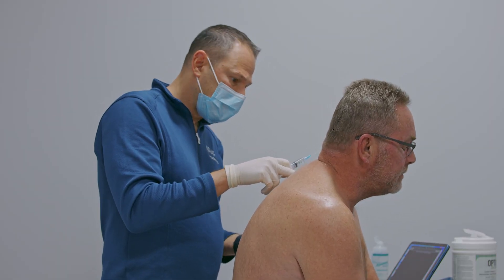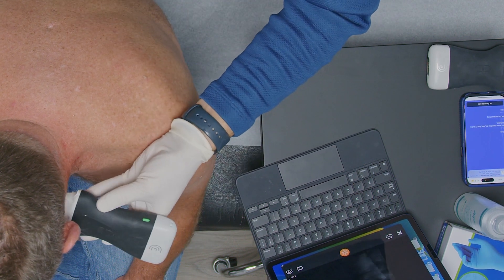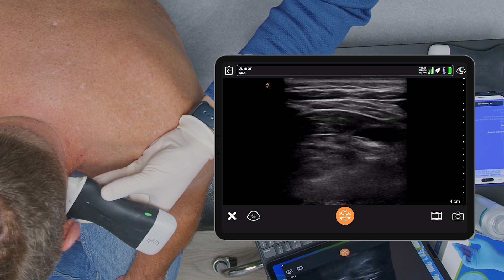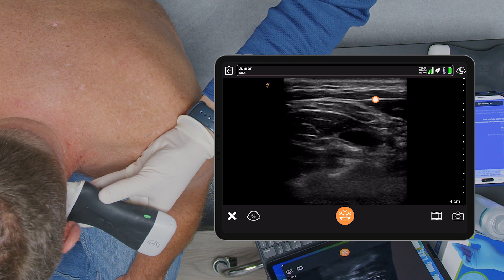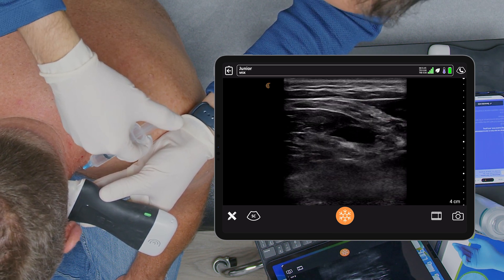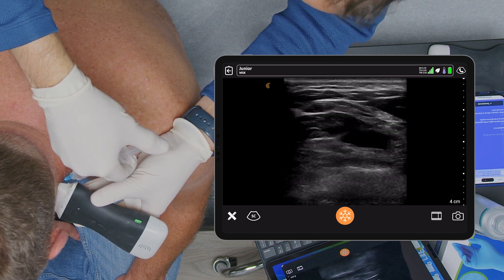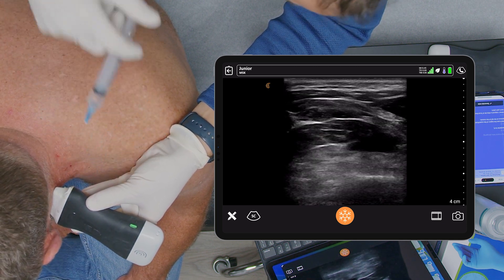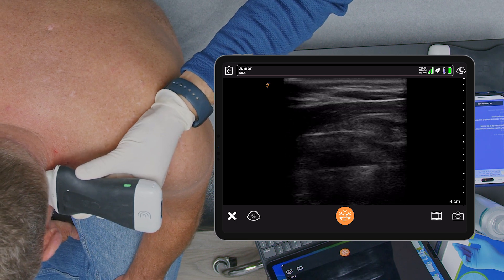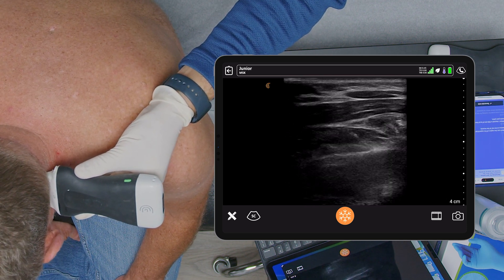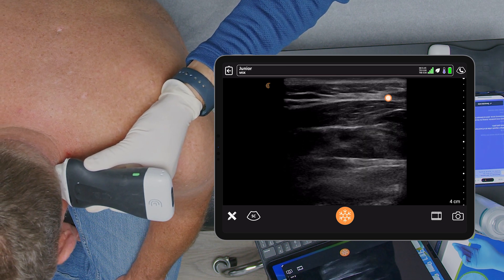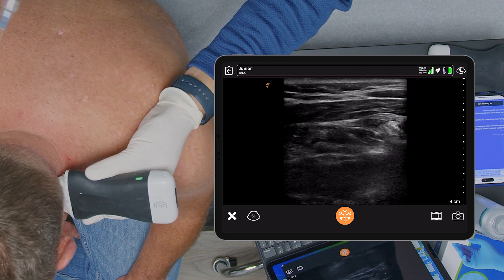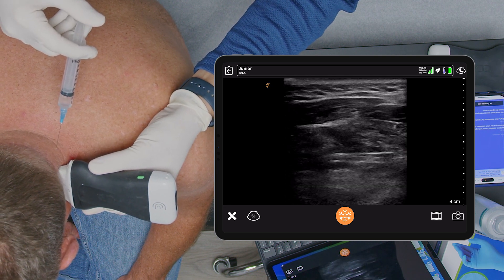I'm going to do two more things. First, I'll do the accessory nerve. What we see here is the sternocleidomastoid — the big muscle here — and going posterior to it, we'll see the region of the superficial cervical plexus at the tail of the muscle. I'm going to deposit a little bit of local there for his neck pain. Then coming posterior, looking for the plane of the accessory nerve, which is between the sternocleidomastoid and the trapezius muscle. The nerve heads towards the trapezius after it leaves the jugular foramen.